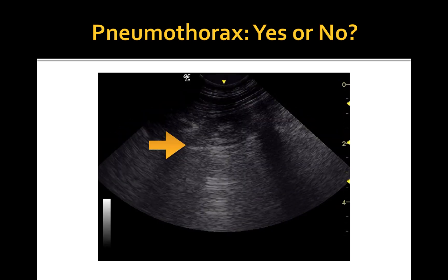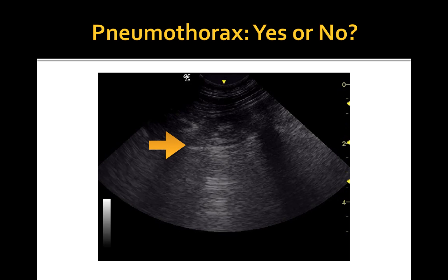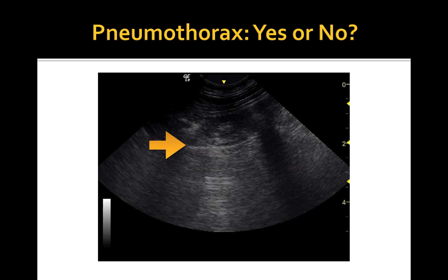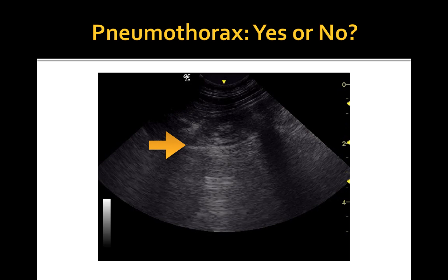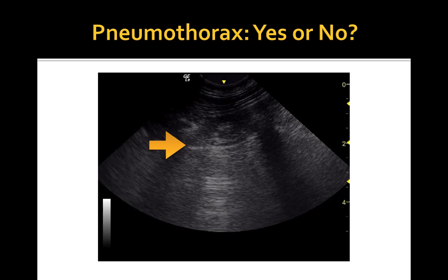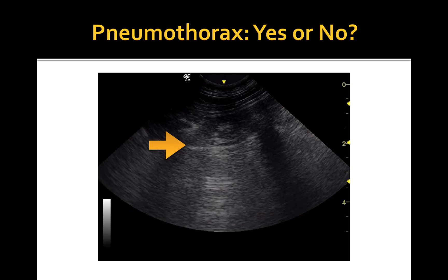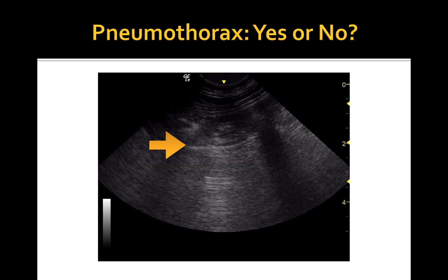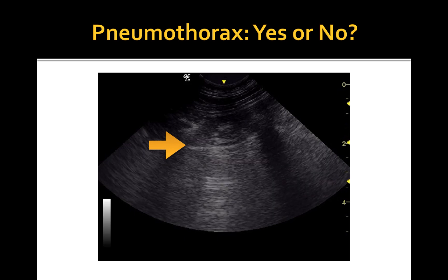In this case the patient has a pneumothorax. Even though there is some motion of the chest wall and muscles caused by patient respiration, there is no shimmering or obvious gliding at the level of the pleural line.